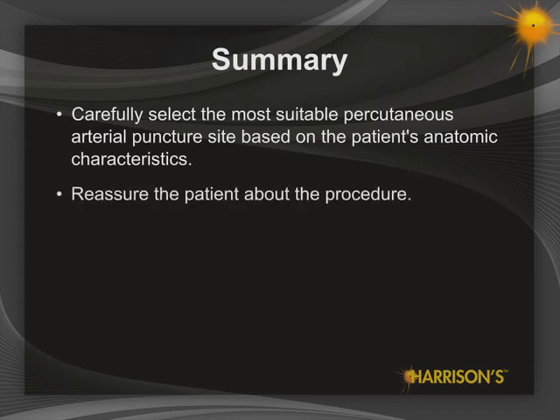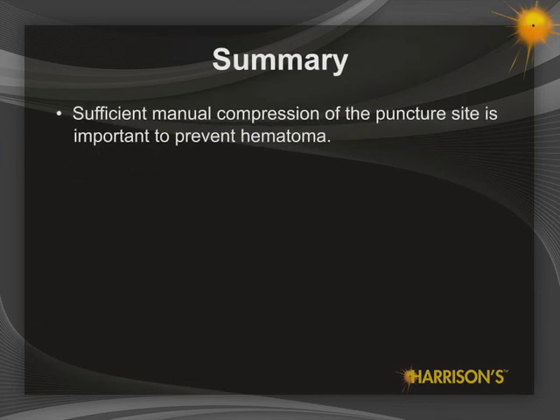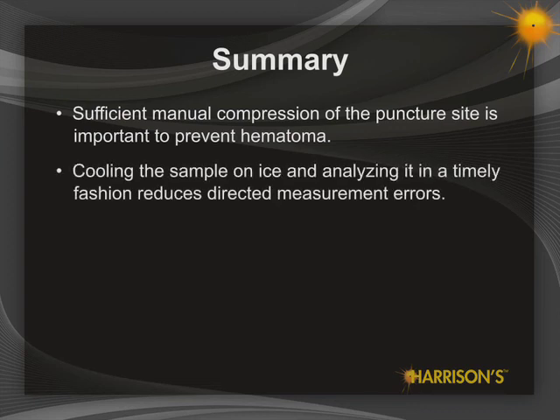Reassure the patient about the procedure. It is essential to optimally position the patient to minimize their discomfort and to follow strict aseptic precautions. Sufficient manual compression of the puncture site is important to prevent hematoma. Cooling the sample on ice and analyzing it in a timely fashion reduces measurement errors.